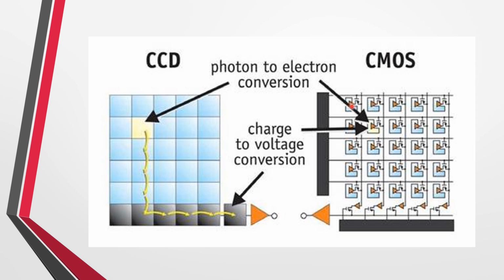But both of these collecting elements convert the photon energy to electrons, and electrons are essentially electricity. The things that handle complex electricity and can change what they do with it we call electronics, so there's electronics inside each one.